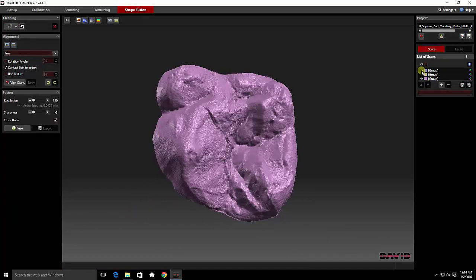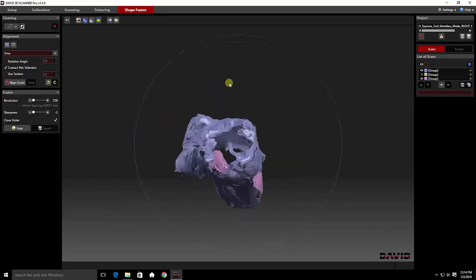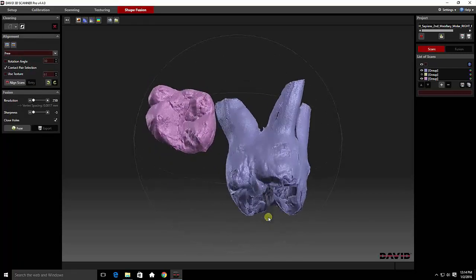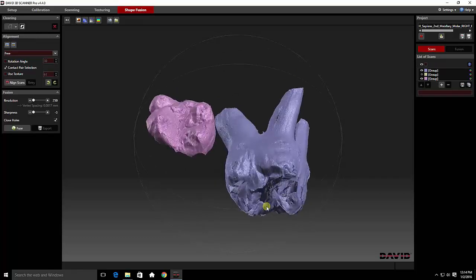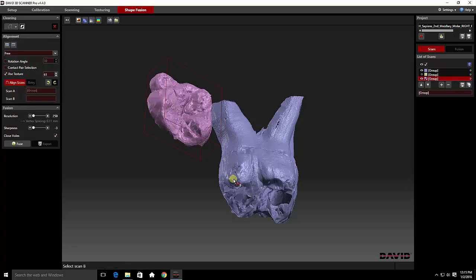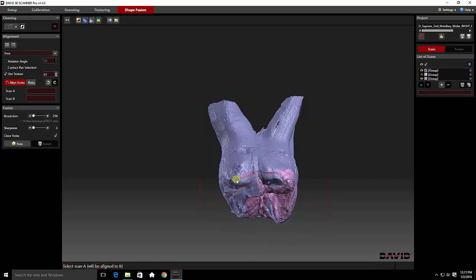The next thing we want to do is start putting our pieces together. We have the outside of our tooth with a lot of information missing on the top, and we have the crown of our tooth. So first, let's line these up so we can see them. We want to select an area that's common to both so that they can be properly aligned. I always start off just allowing the computer to line things up — I very often get good results. So my first step is to leave texture turned on and align scans. I select to align this scan to this scan and let it do its thing. Beautiful results.